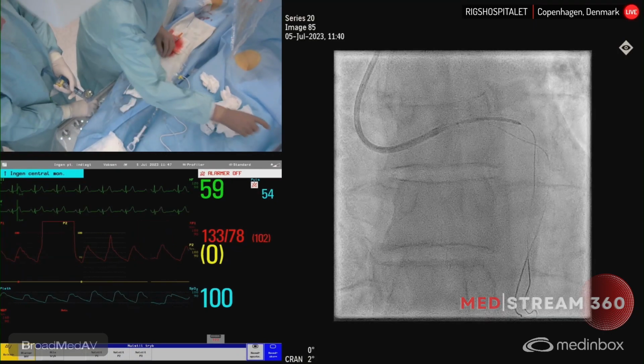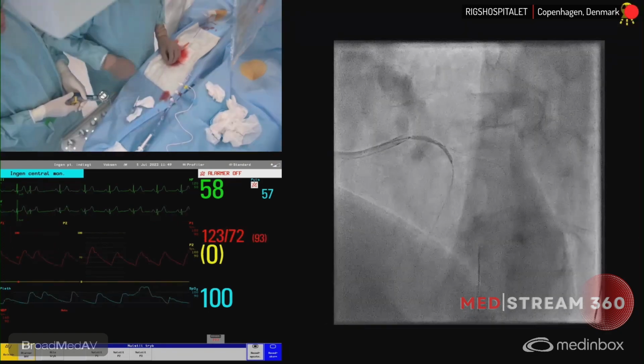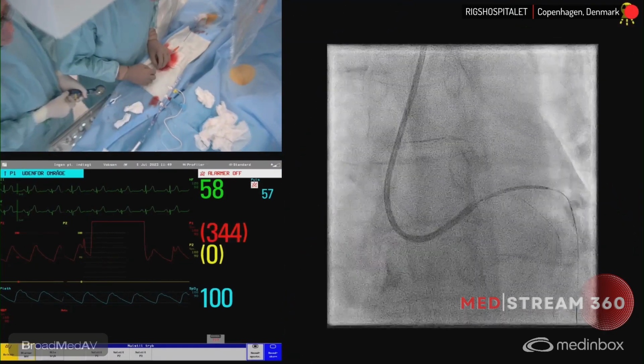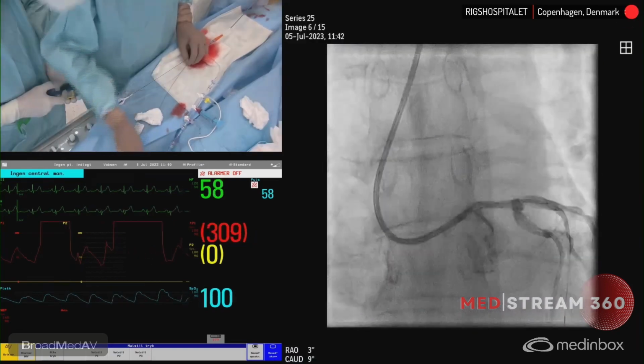So we go to the cranial. I think you need to push it 1 millimeter. You drag the stent just half a millimeter, but I think that was good. Let's just check here, because that one was actually just not much, a little. We go just half a millimeter, yeah, to retract it.